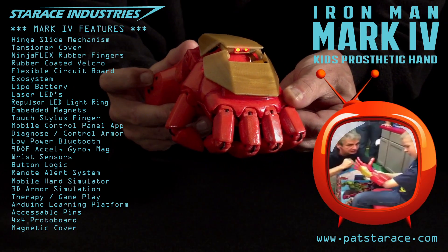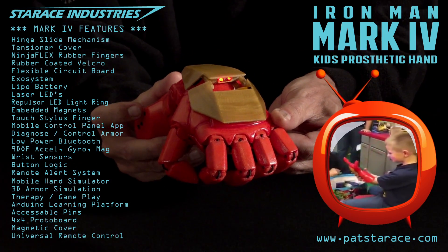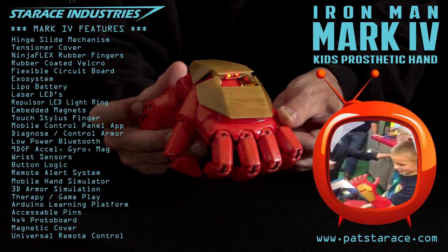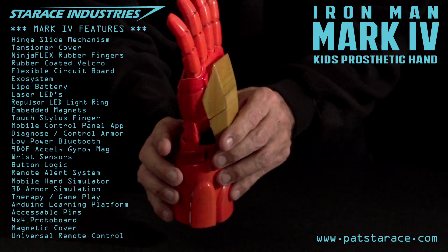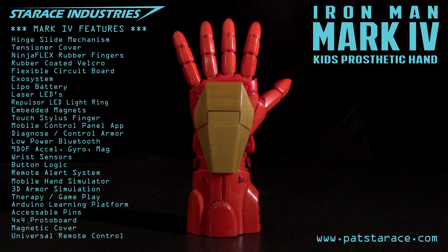It's an infrared pulsed light generator — a universal remote control. The buttons are power on, channel up, and channel down. It can also be programmed for any infrared device. The Mark IV is complete. Deploy the armor to Iron Kid. Yes sir. It will be my pleasure.